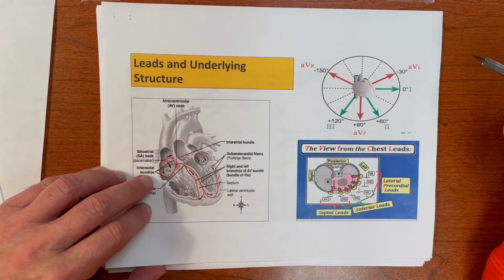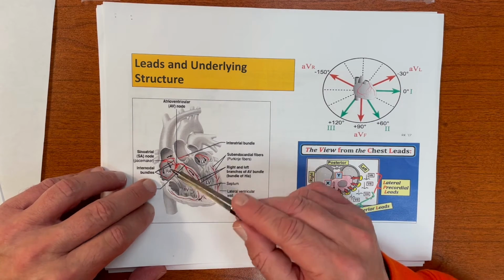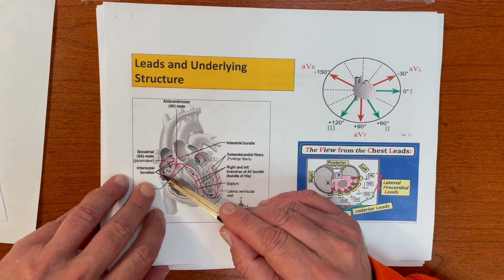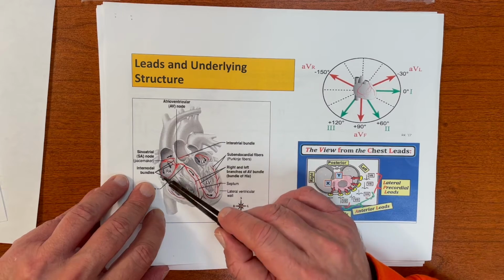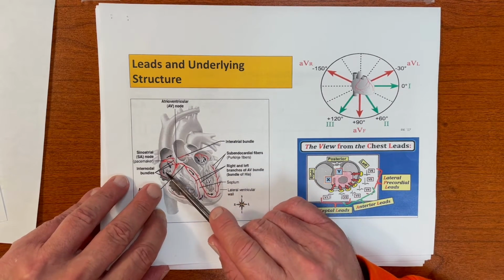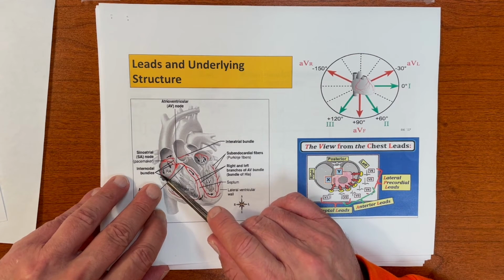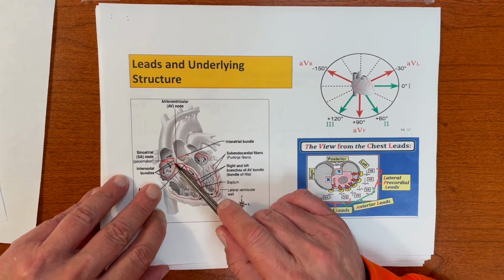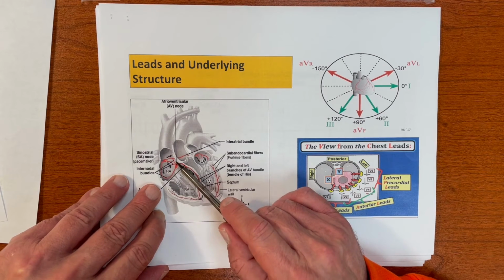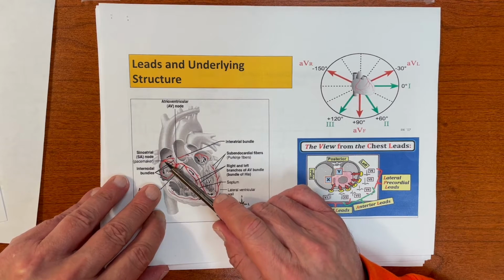No, a P wave only tells you that the atria was depolarized. Okay? Because look, if my cardiac cycle is going to start from an electrical impulse outside of the sinus node but in the atrium, it's still going to depolarize the atrium. I'm still going to have a P wave. So it's not just a P wave. It has to be morphology.